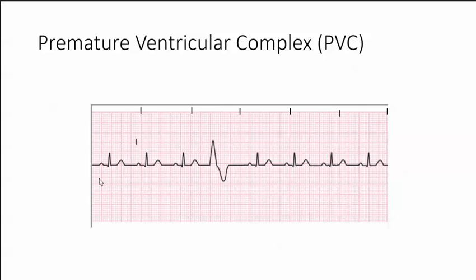Let's take a look at this strip. In this first complex we have a normal P, normal PRI, normal QRS, and the P wave comes before the QRS. So we have a normal sinus rhythm — sinus, sinus, sinus, sinus, and sinus. They all look alike; it's all good.